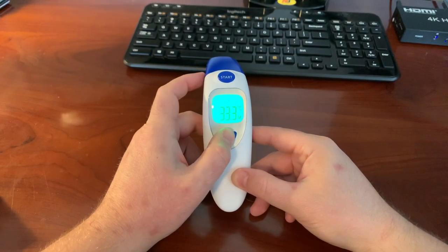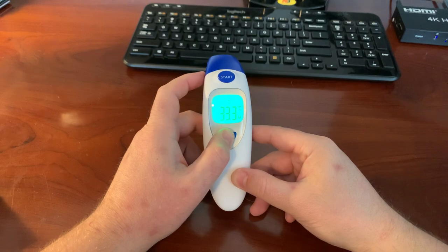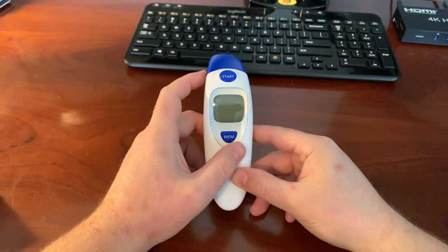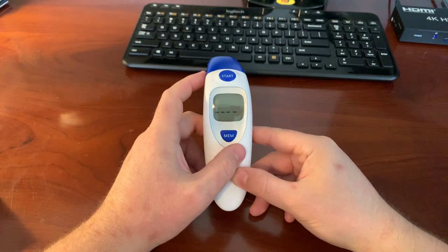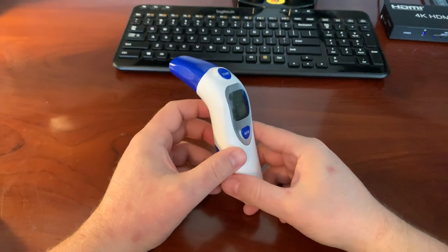Now if I wanted to change that back to Fahrenheit — from off, six seconds on the memory button, tap it once to degrees Fahrenheit, let it turn off by itself. Now you're on degrees Fahrenheit.